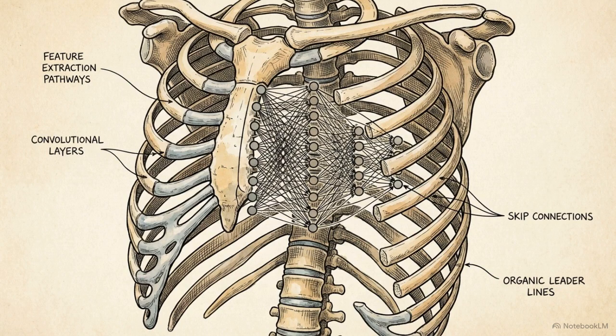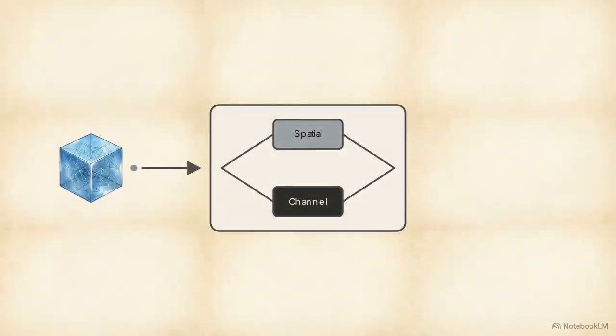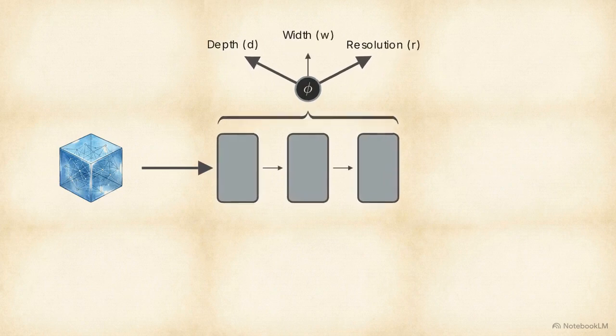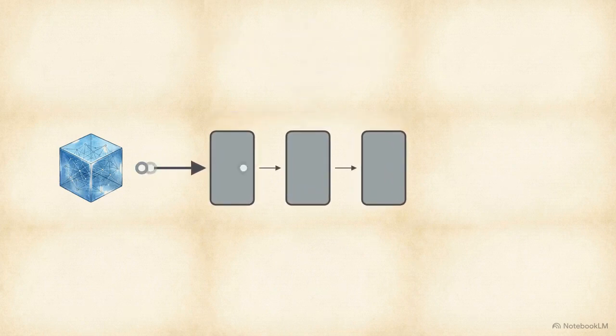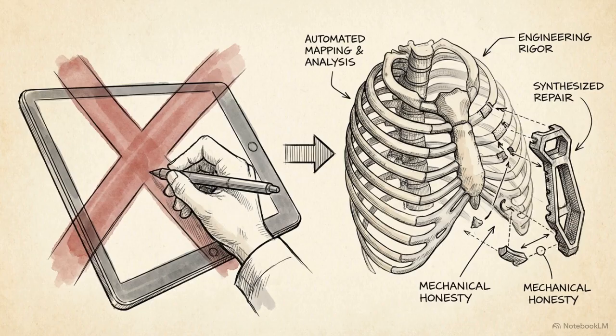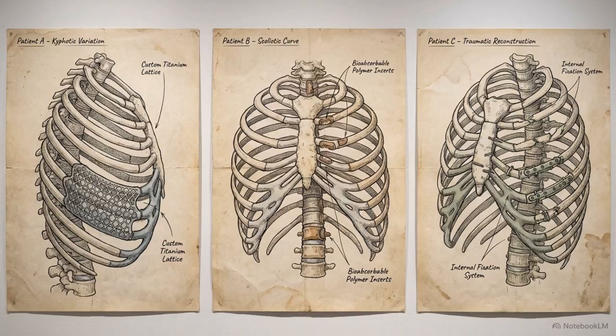To increase representational power, the model integrates a pre-trained EfficientNet B0 encoder. EfficientNet utilizes compound scaling and depthwise separable convolutions, extracting structural features efficiently from complex medical images without requiring massive computational overhead. Mapping a defective ribcage volume directly to a predicted implant volume eliminates the need for manual boundary tracing. It allows for end-to-end learning tailored exactly to each specific patient's missing anatomy.